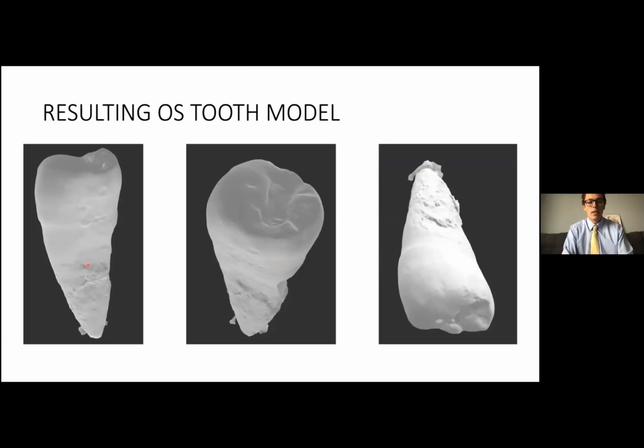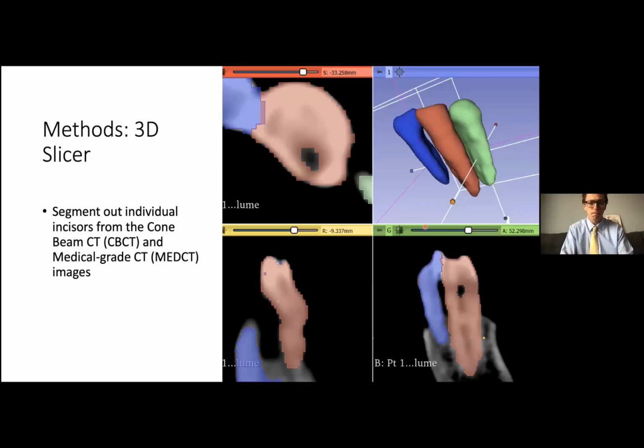So you can see in this slide, we have three images of the same tooth, and these software renderings of the tooth on the previous slide are within 10 microns of that actual tooth. And so we trust this. There's literature backing that number. This is our standard that we're going to work with to compare other digital 3D models from the CTs.